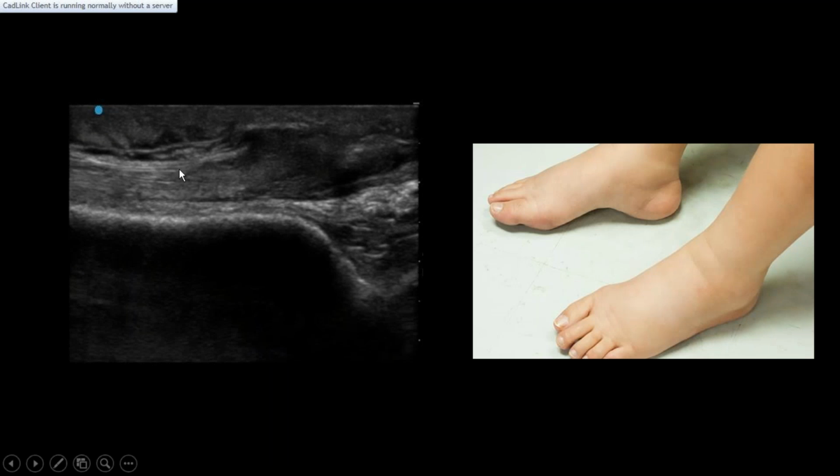Now, I have that image again here. When the patient presents with a lot of swelling around the area, especially people with comorbidities like heart disease, hypertension, hypercholesterolemia, or some other connective tissue disorders, they have swelling or edema in the feet, and if they have a rupture of a tendon, it's difficult to know with physical examination because you cannot palpate the proximal stump of the tendon.